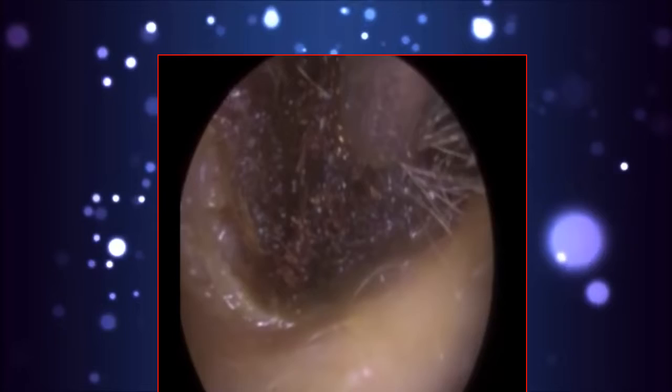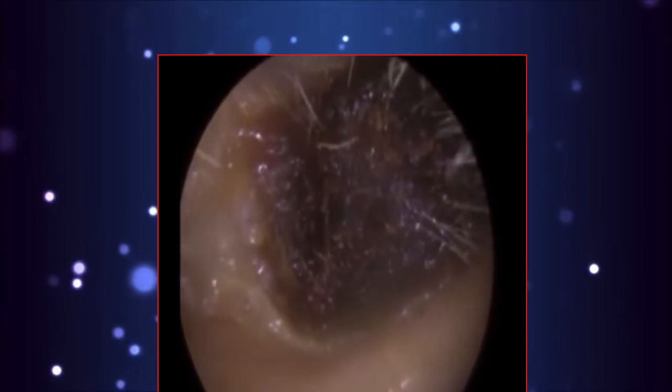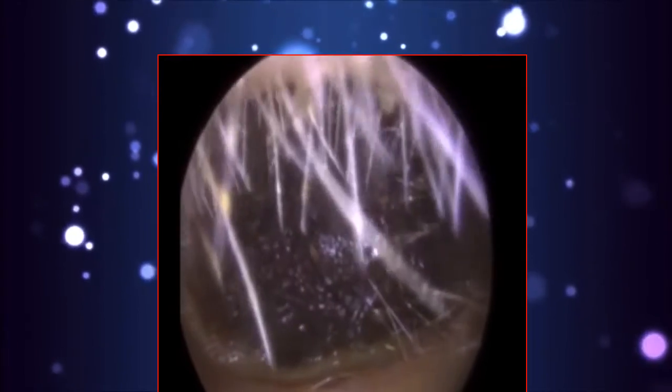I'll try and endeavour to put a picture of a cast. I've got a really good one actually I took a few weeks ago of the anatomy of one's ear canal, because it's not always visible when you're removing earwax. So I will upload that and you'll see sometimes the second bend can be almost 90 degrees. So this wax is lodged behind that bend.